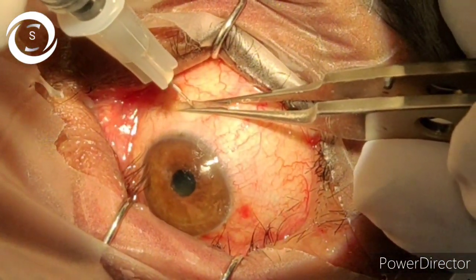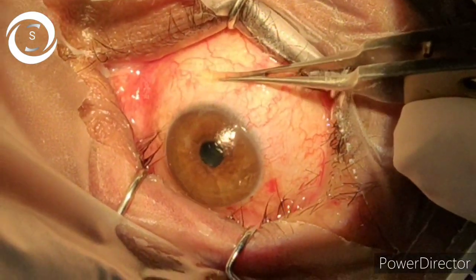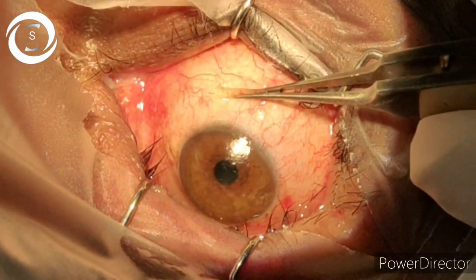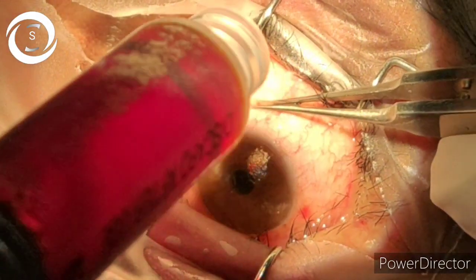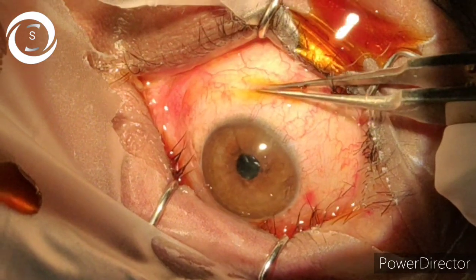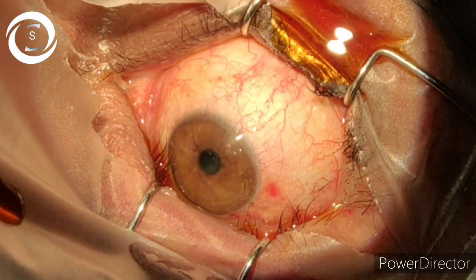Then at the time of injection, try to remove the extra personnel from the room and ask the patient not to speak during the procedure. Put 2%. You can also use the traditional 5%, but I put 2% povidone iodine into the eye. Then put on sterile gloves, insert the lid speculum, drench the conjunctiva again with 2% povidone iodine, again put a topical anesthetic drop, mark the injection site with a caliper, and inject into the globe aiming at the center of the eye.